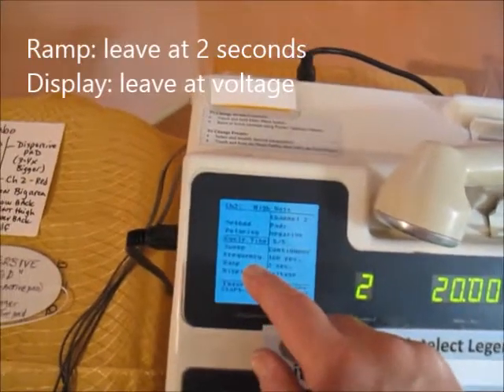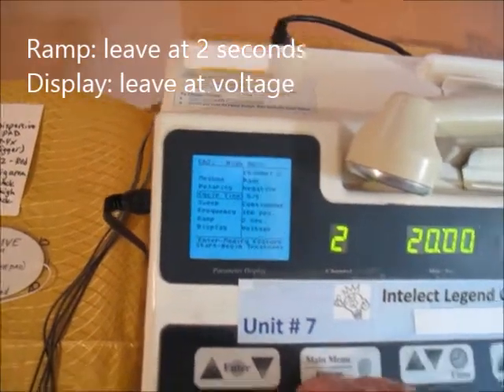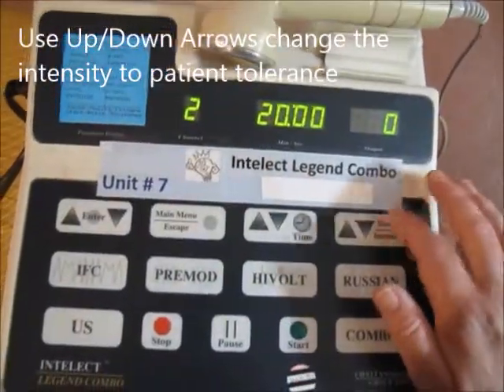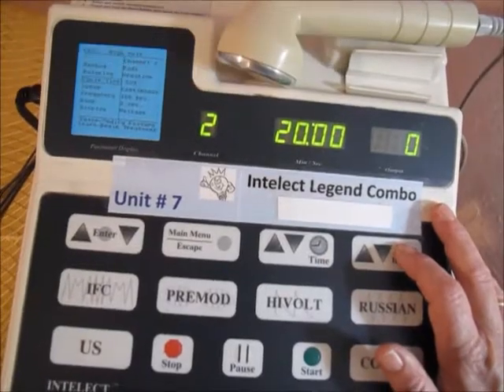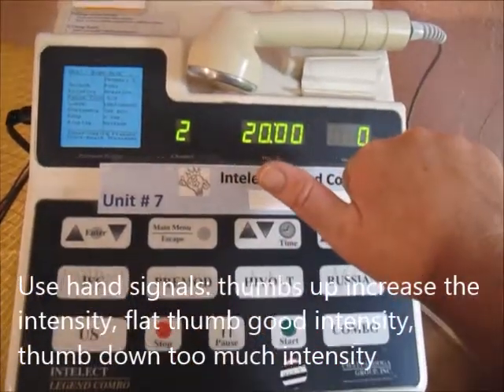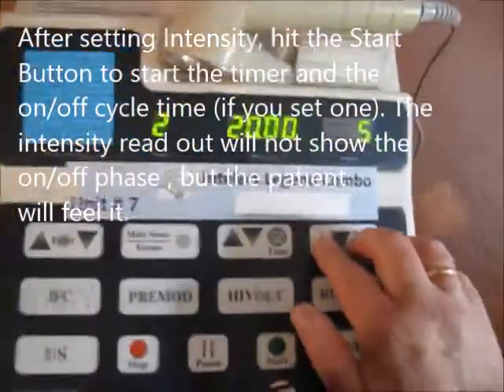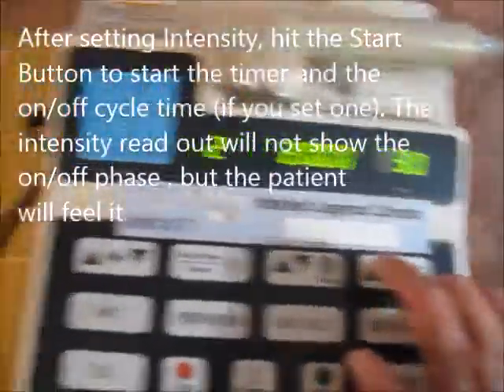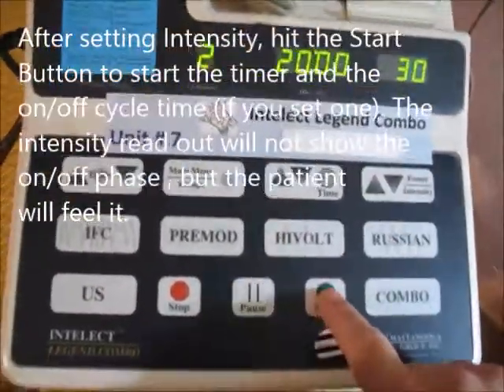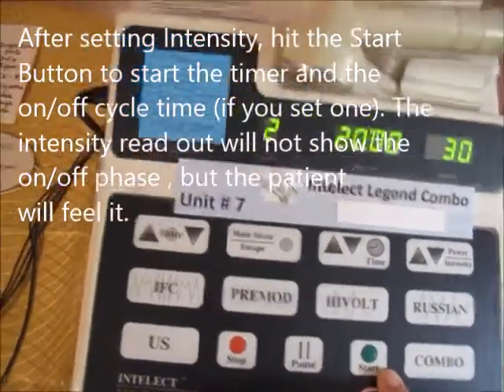You don't need to adjust the ramp — that's just how fast the impulse comes in — and you don't need to adjust the display, so leave both alone. To start the treatment, increase intensity using the up arrow, asking the patient whether it feels good or bad as they're lying face down. After setting intensity, hit the start button to start the timer and activate the on/off phases of the cycle time. The patient will feel the difference, but you won't see a change in the intensity box on this unit.